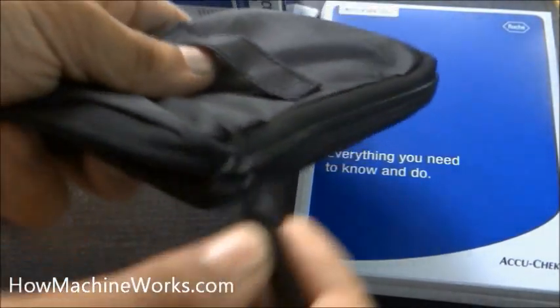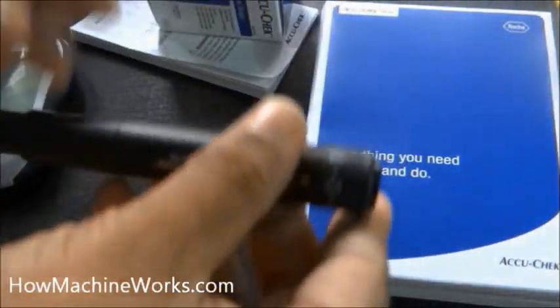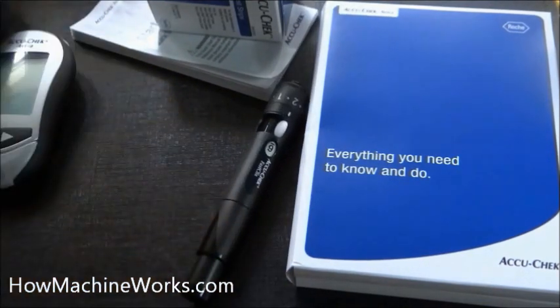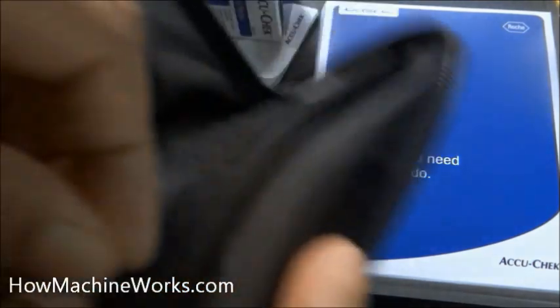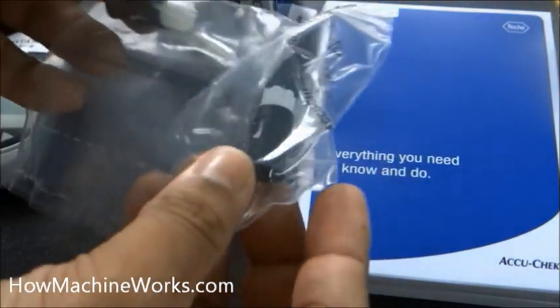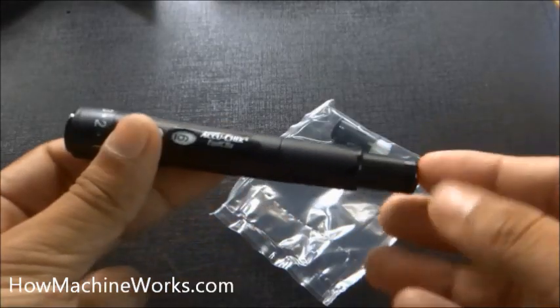Let's see what we have inside the pouch. That's the finger pricker. We'll learn how to use the finger pricker. We also have the lancet drum — two fresh lancet drums, and each lancet drum contains six lancets. It needs to be installed into the finger pricker.